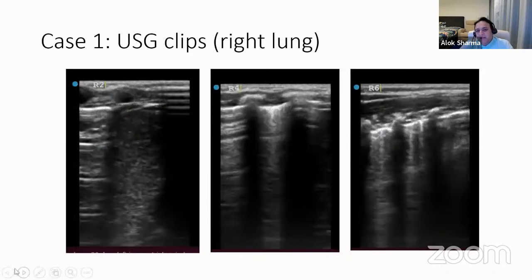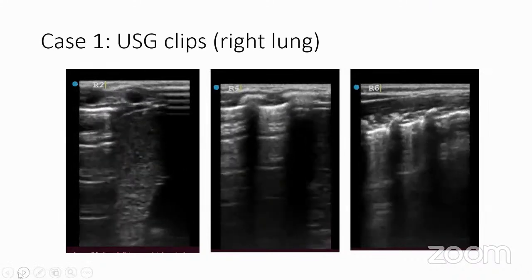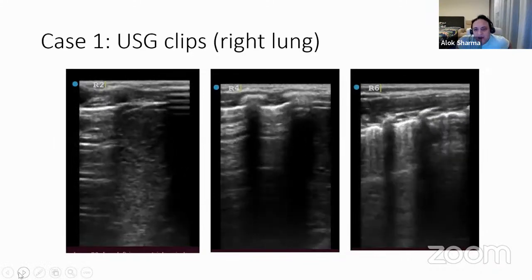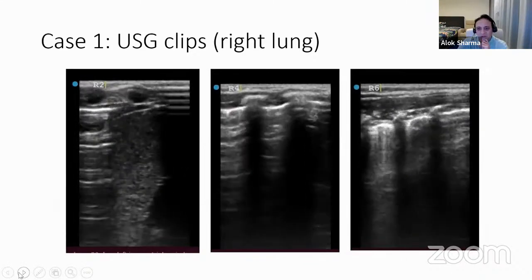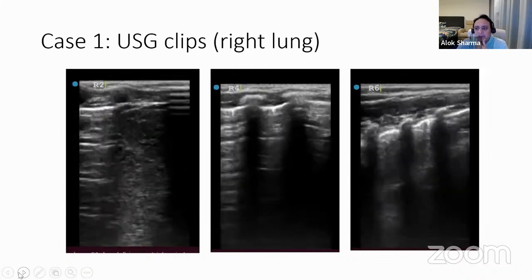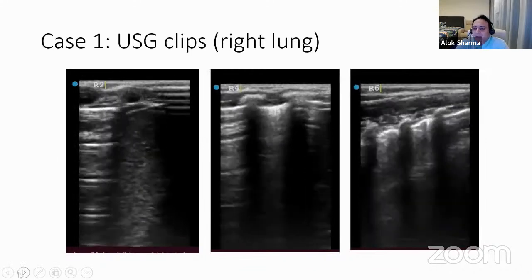So the baby, did the baby have any respiratory distress? Nothing. Barn door normal. Okay. And again, this is where I would say clinical correlation is key. Looking at R6, somebody might want to say, well, those lungs look wet. But actually what I'd say is this is gravity for you, in a baby who has no respiratory distress and is clinically well, who's 3 days old.